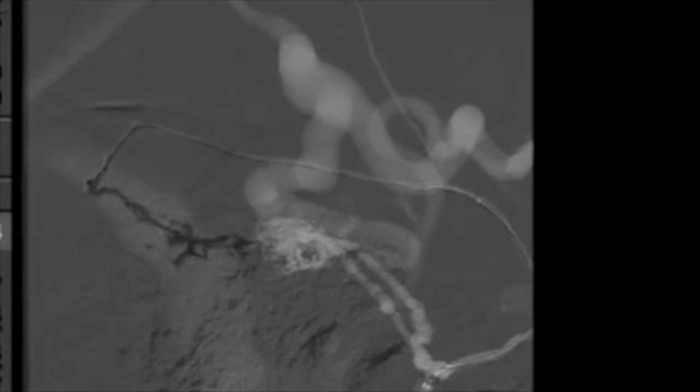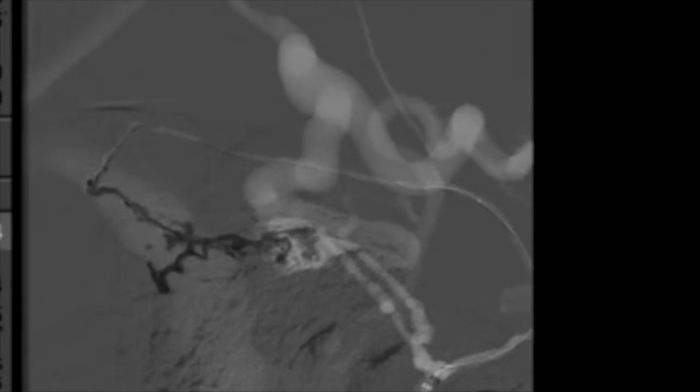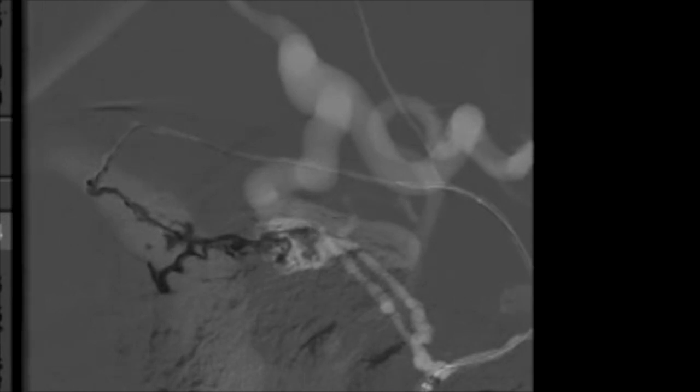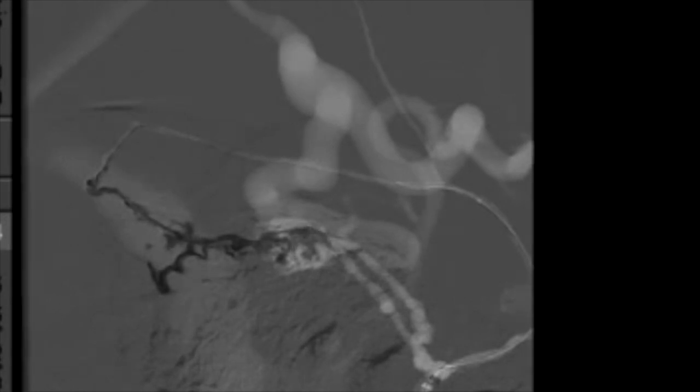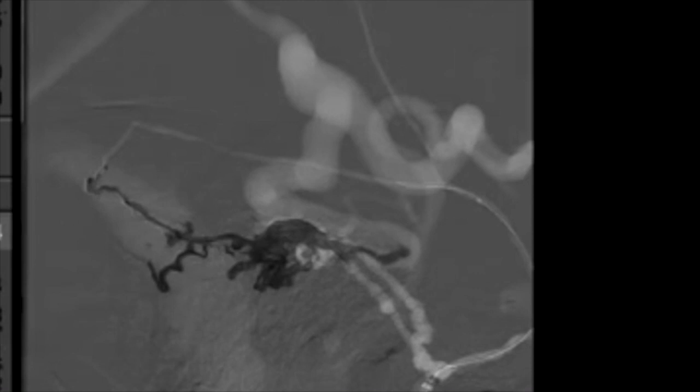Here the onyx is going first into the branches of the occipital artery. Once some of those branches are embolized, the onyx keeps going into the actual fistula connection and into the venous pouch. More onyx is injected to really fill in the venous pouch and the fistula connection.